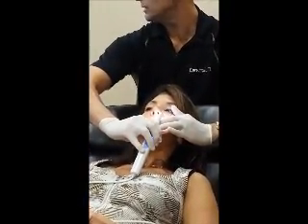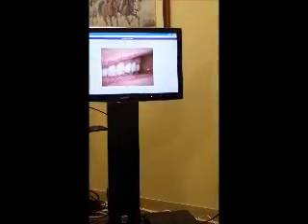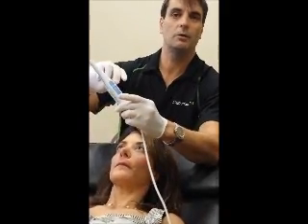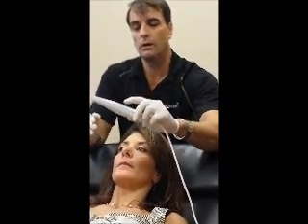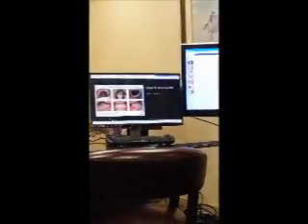With cheek retractors, you can see looking at the screen that you could easily get the shot Invisalign is asking for. So those are the extra-oral images — those were all taken with the camera on the top light. Anytime you're doing extra-oral, make sure you're on the top light. We're going to go inside the mouth, and for that I'm going to adjust to the second light, which is the two-to-three tooth view.